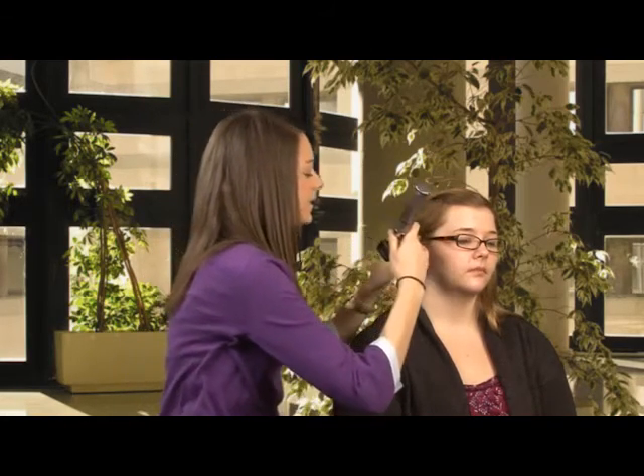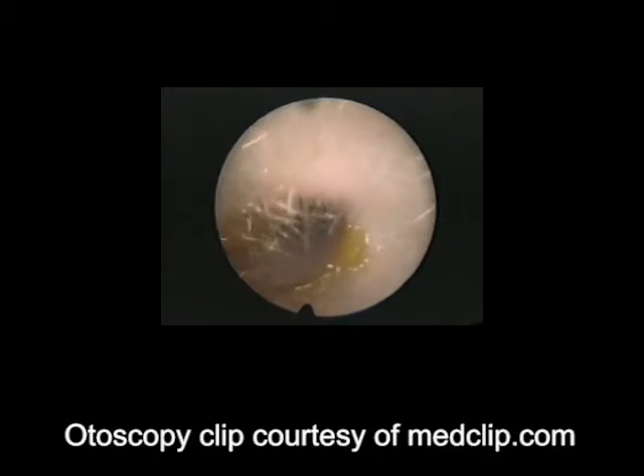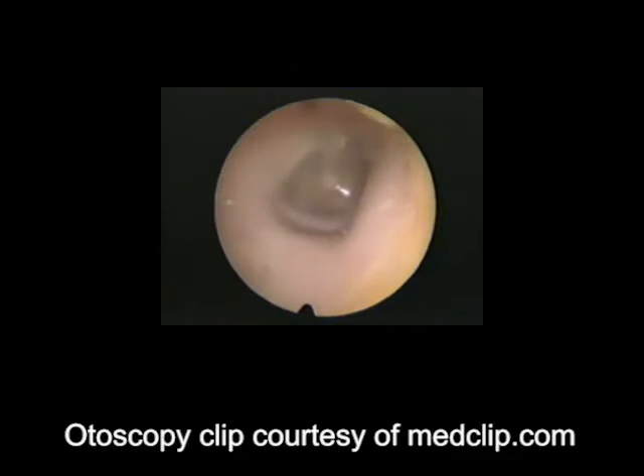Tell me if you feel any discomfort. Now I'm going to brace with my pinky, pull up and back, and look in. What I'm looking for is the external auditory canal — I'm looking for wax, foreign bodies, any inflammation, redness, blood, anything like that. And then also I'm looking at the tympanic membrane.